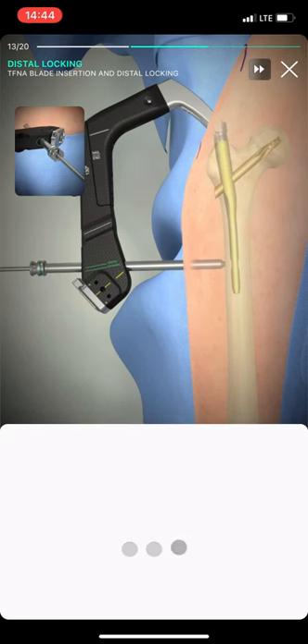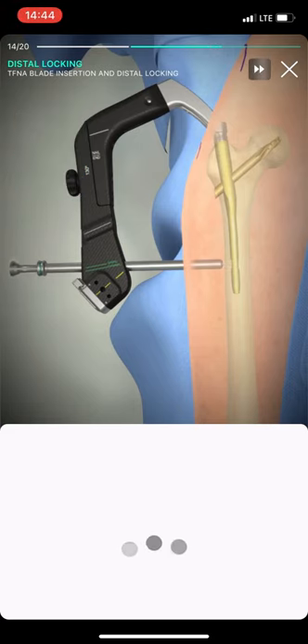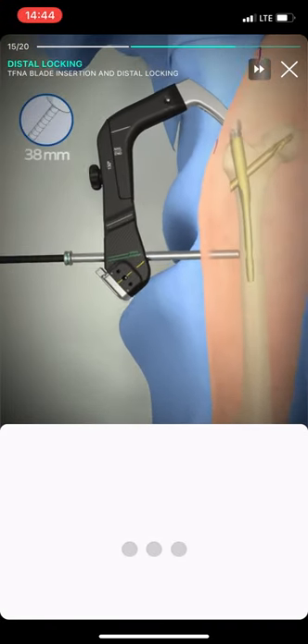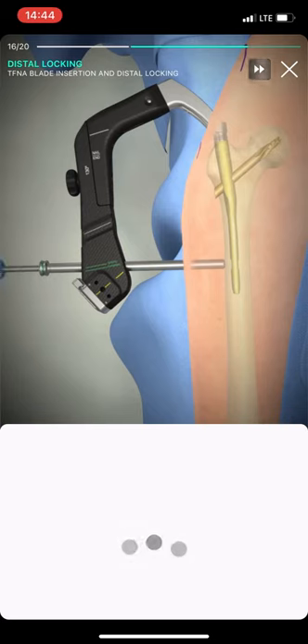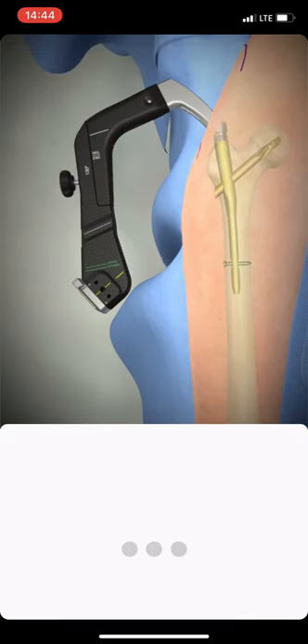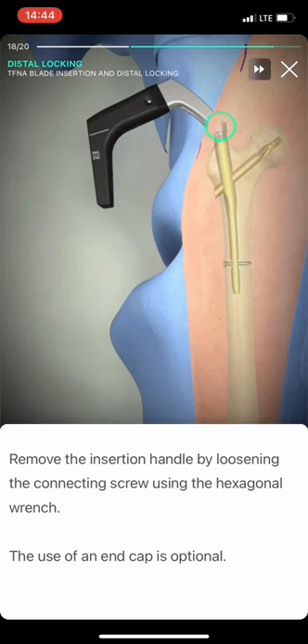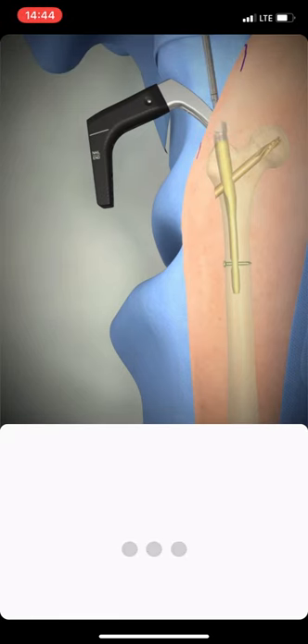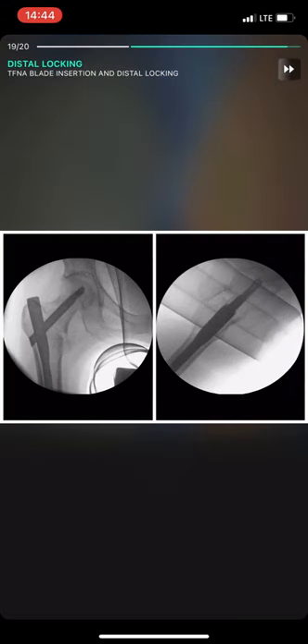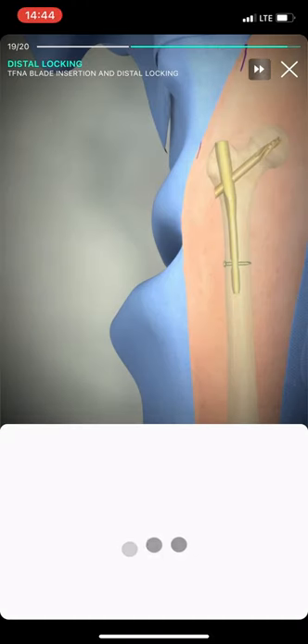Insert the 4.0 mm drill bit and drill through both cortices under image intensification guidance. Check the final position of the implant in both planes. Close the layers in an anatomic manner.